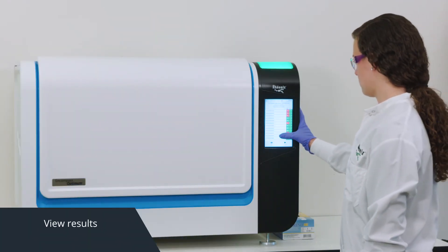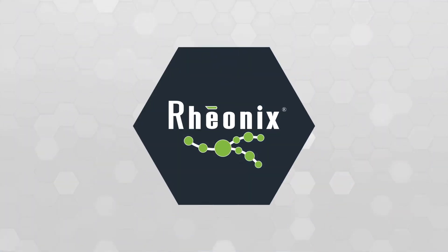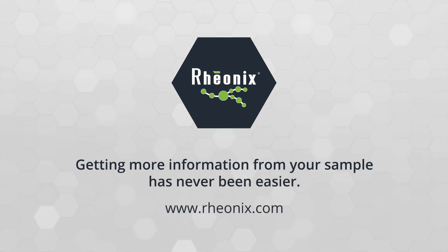Then simply press start and walk away. It's that simple. When the run is finished, view results directly on the workstation, or upload for later review. With Rheonix, getting more information from your sample has never been easier.